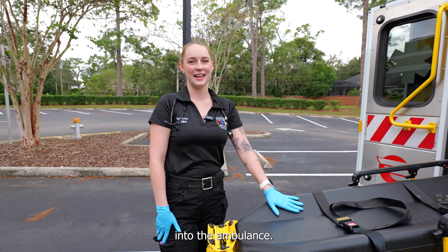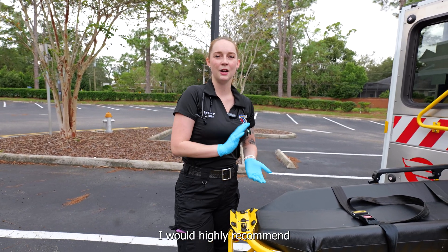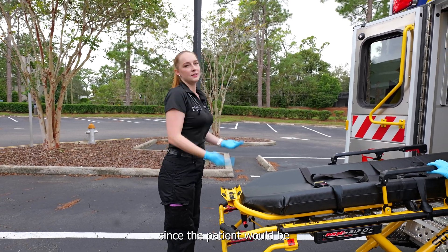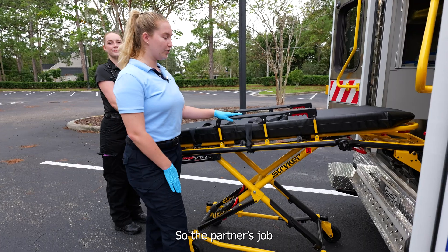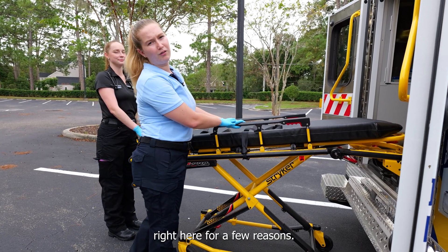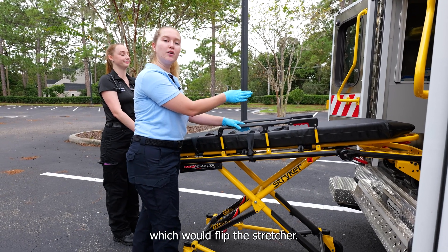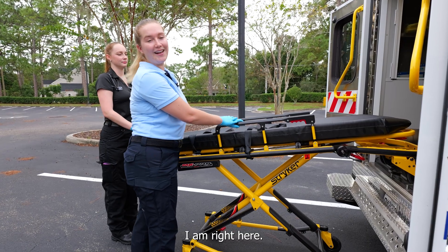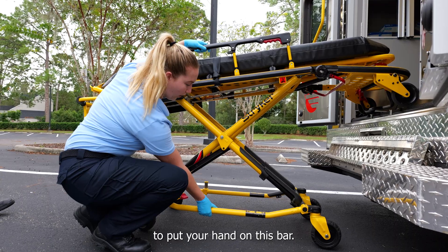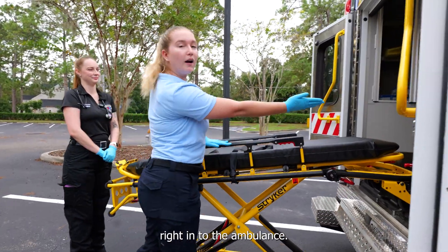Now we get to put the stretcher into the ambulance. The person at the feet of the stretcher who's in charge of locking and unlocking is going to use as much leverage as they can. I'd highly recommend using the one on the bottom so that you're bringing your wrists up to your armpits and not having to come up higher. The partner's job when lifting is to close the stretcher down so that it fits in the ambulance. You want your left hand on this handrail — we want it to feel like we're closing our hands together rather than lifting with only one hand, which would flip the stretcher. It also lets your patient know you are right there. There is a sticker that tells you exactly what to do. Put your hand on this bar and as your partner lifts it up and you hear that unlocking mechanism go, you're just going to close together like an accordion and then slide right into the ambulance.